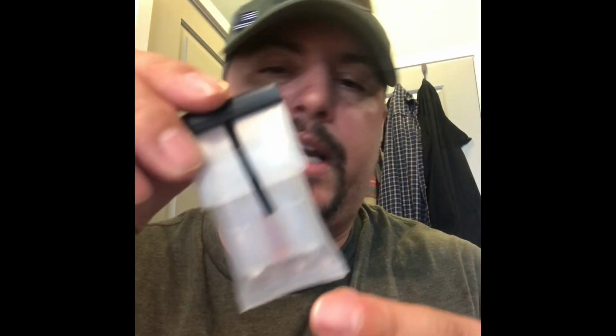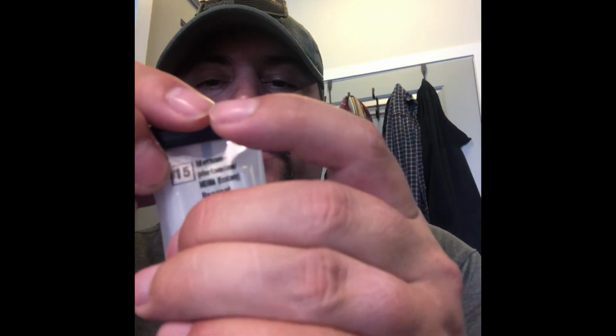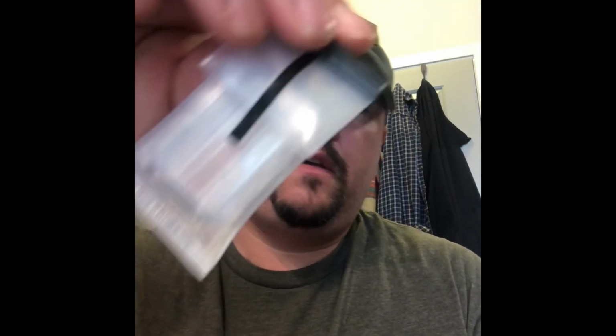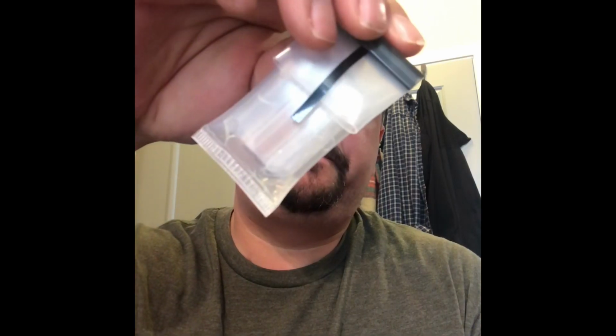We're going to take the meth. You look at the meth from the backside, it's got the center ampule with an orange color liquid in it. Do I know what that is? I do not. However, it is a different color. So I'm going to break this left to right, break this one first, and you introduce that first liquid. It's clear, right? There's nothing in there except that clear liquid. Shake it around a little bit. I think that's probably good enough.